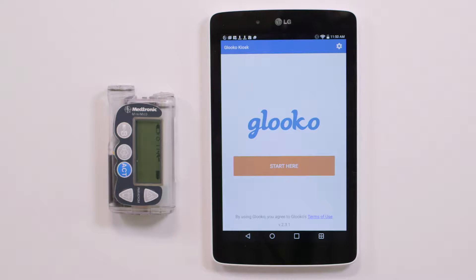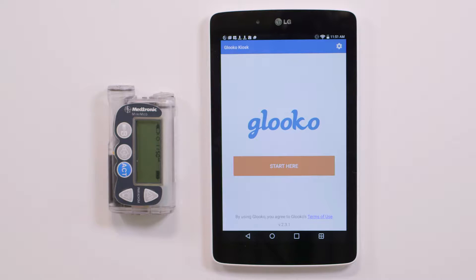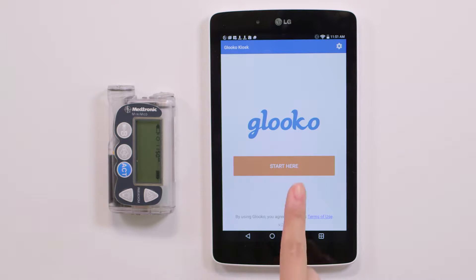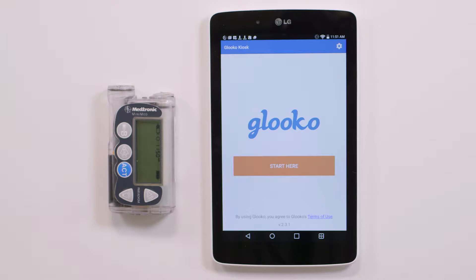Hey there, welcome to Gluco. Today I'm going to show you how to use the Gluco kiosk app to connect your patient's MiniMed Connect and CareLink personal account to Gluco. In order to do this, you will need an Android tablet with the Gluco kiosk app installed and the patient's existing CareLink personal account information.